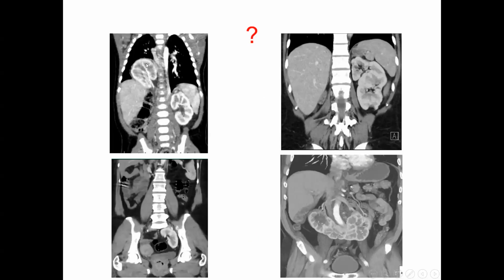So this is intrathoracic kidney, inside the thoracic cavity. This is cross-fused ectopia. Okay, the kidney has gone and fused with the other side. The left kidney is here and the right one is lying here. So you have two collecting systems. The collecting system of one, it will open on this side. This is pelvic kidney. Okay, this is horseshoe kidney.